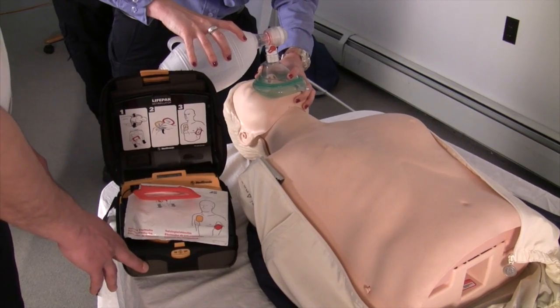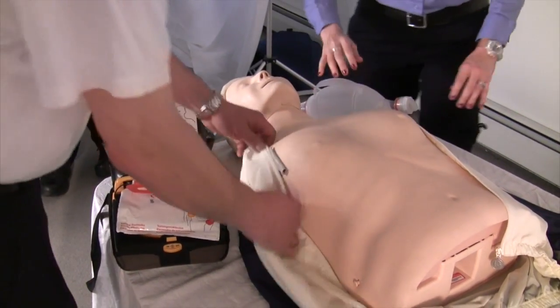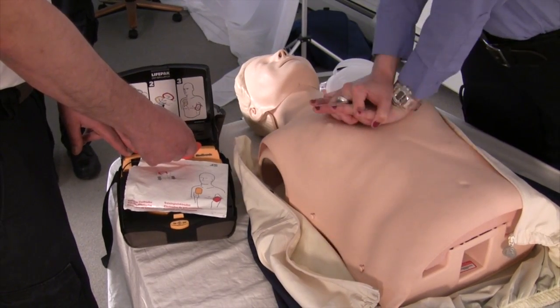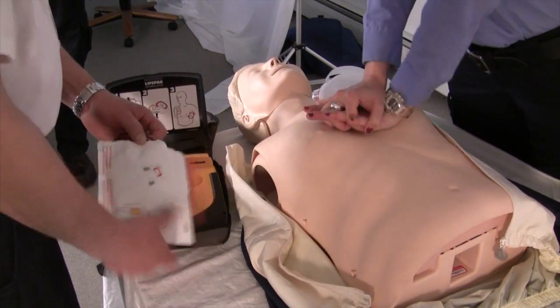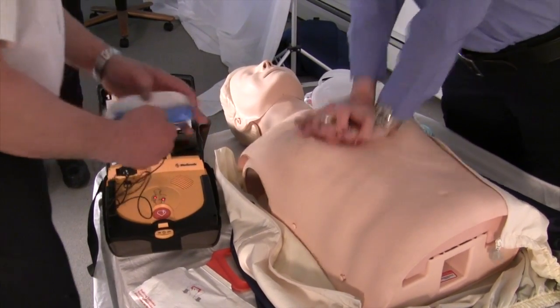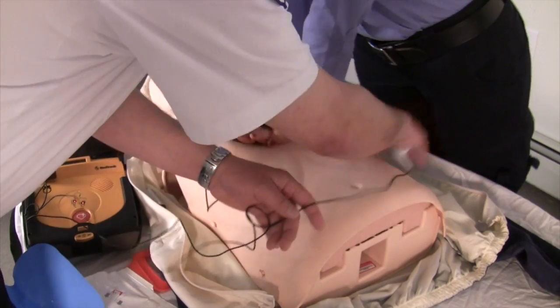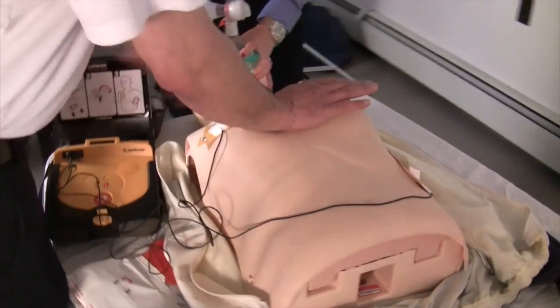Remove all clothing from the patient's chest. Pull red handle to open bag. Look at pictures on pads. Peel one pad off blue plastic. Apply pad to bare skin, exactly as shown in the picture. Press pad firmly.